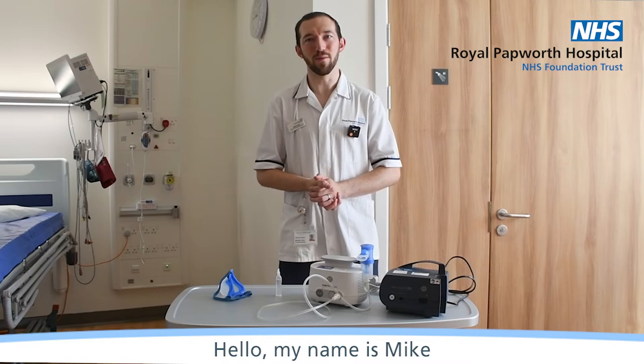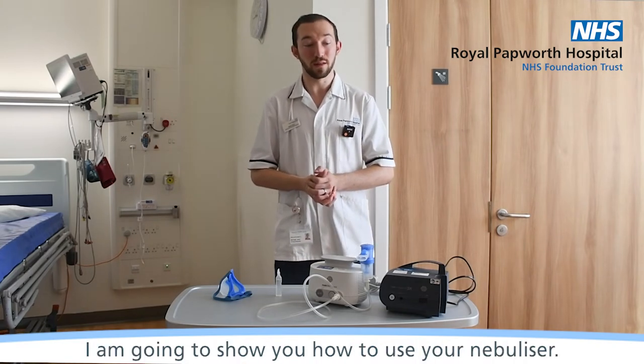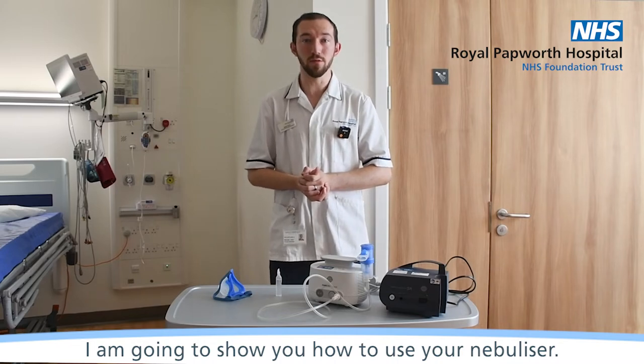Hello, my name is Mike and I'm a Specialist Physiotherapist at Royal Papworth Hospital. Today I'm going to show you how to use your nebuliser.